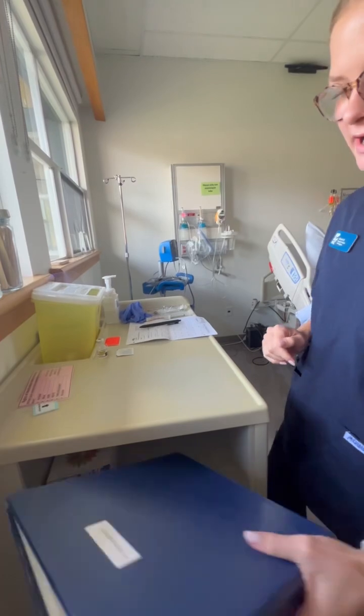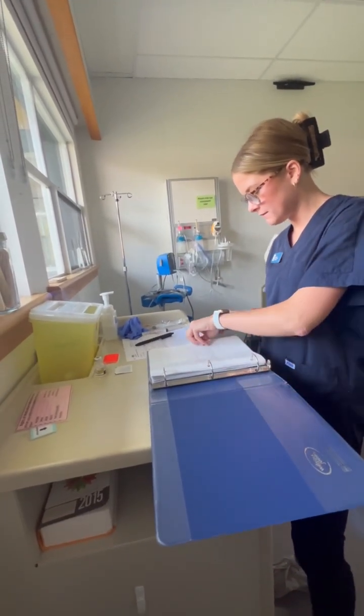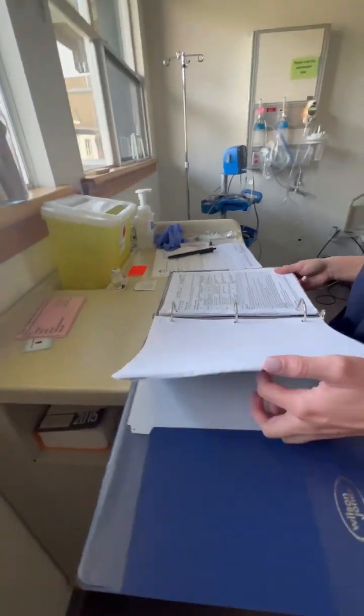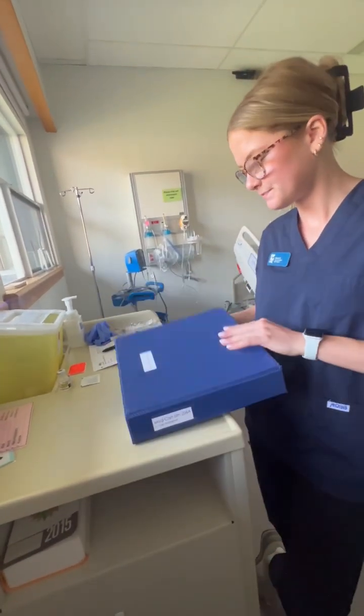Before pulling out the medication, I am going to consult the IV monograph for morphine here. All right, so for morphine here, I can see that it can be given IV direct. I'm going to mix it with 5 to 10 milliliters of normal saline, and I'm going to take note of the rate. It is 2 milligrams per minute. I am administering 2 milligrams here outlined on the MAR, so I am going to make sure that I administer the medication over 1 minute.